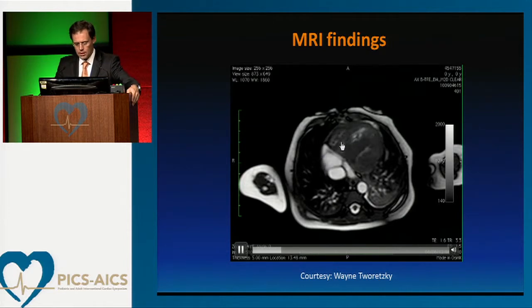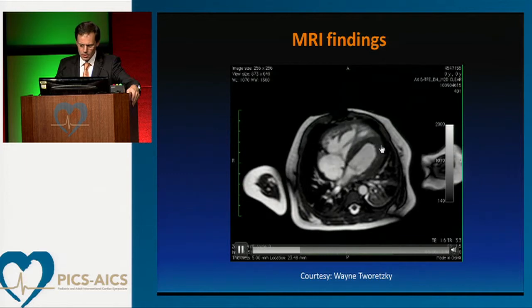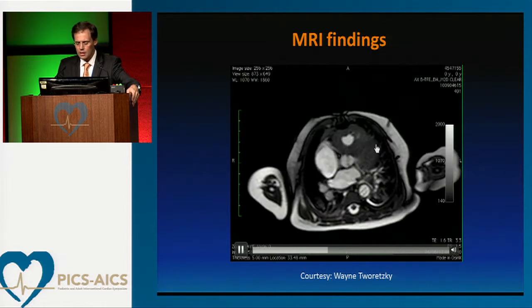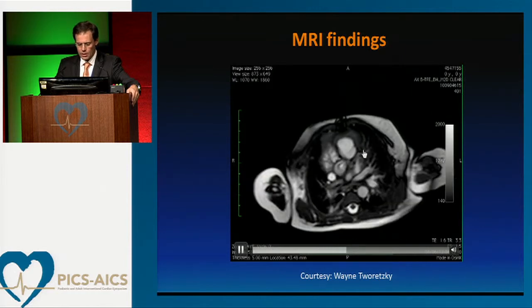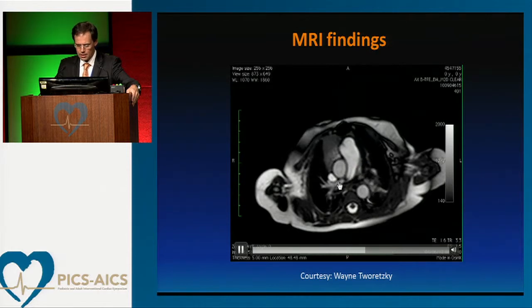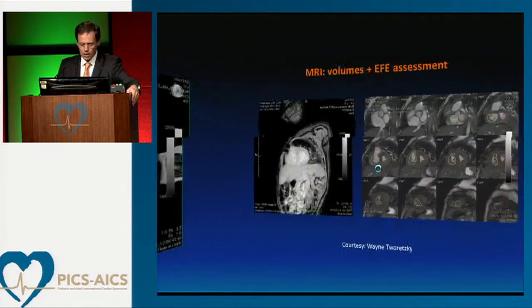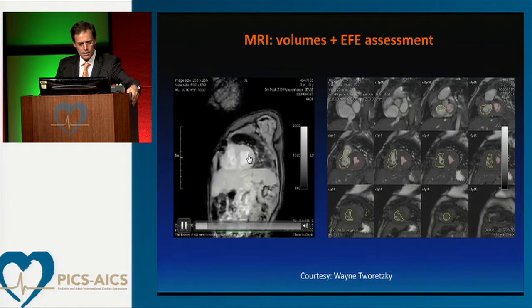One can see here the big right ventricle, and the left ventricle here, very hypertrophied. We're going to see some AI. There's the ASD shunting left to right, and the stenotic aortic valve. We're going to see the bands in a minute. That's the right pulmonary artery, and that's the left pulmonary artery. So some more pictures of MRI. One can see the fibroelastosis here all over the place.